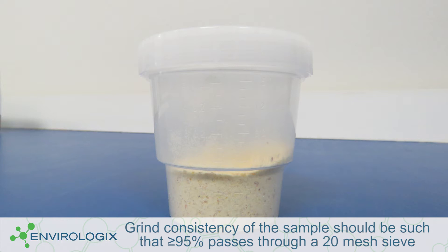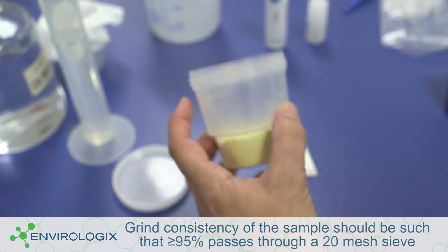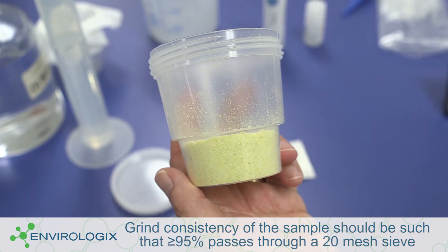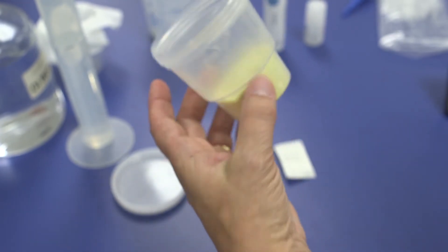When testing a 25-gram sample, place 25 grams of ground sample into a suitable hard-walled container, such as a disposable 5-ounce sample cup with a lid.